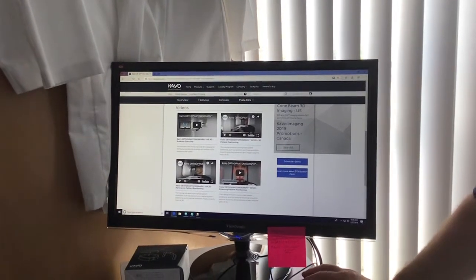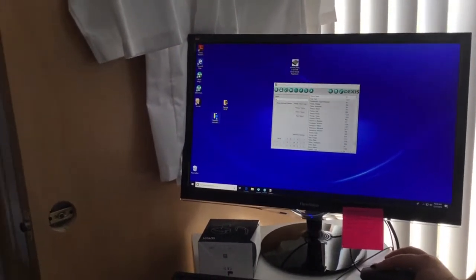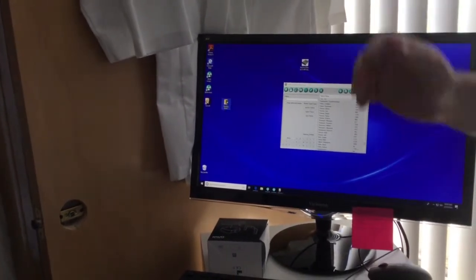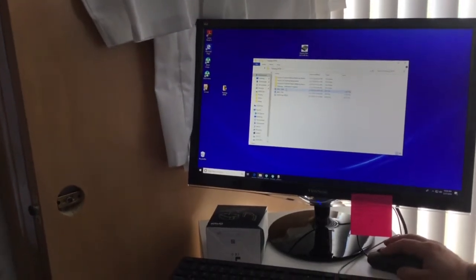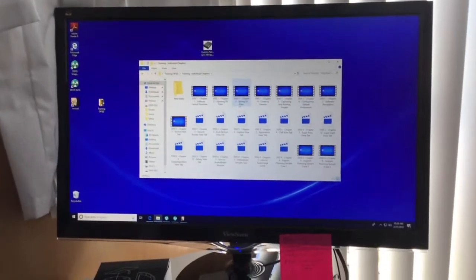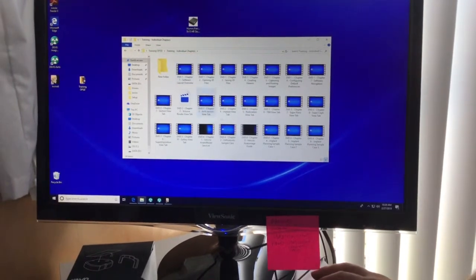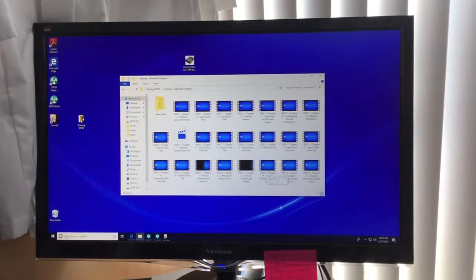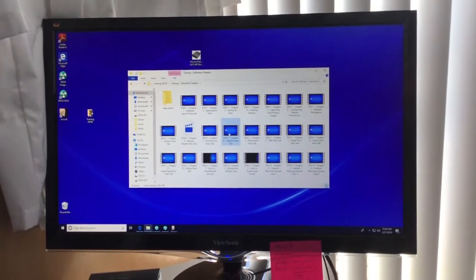I also put them on the desktop, and the trainer's probably going to give you some videos too. If you want to jump drive it all over to your own computer or wherever you want to view them, there's a bunch of OP3D training stuff in here. This individual chapters one is a really long CD series. It's one version earlier of the 3D software, but it's really in depth. How do I do an implant sample case? What does the superimposition tab do? What does the implant tab do?